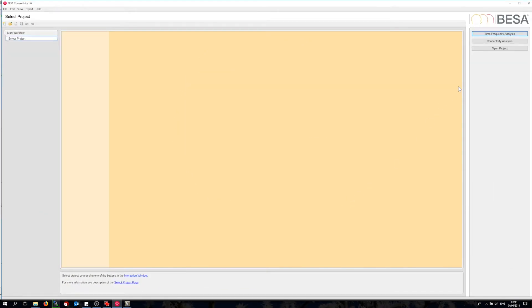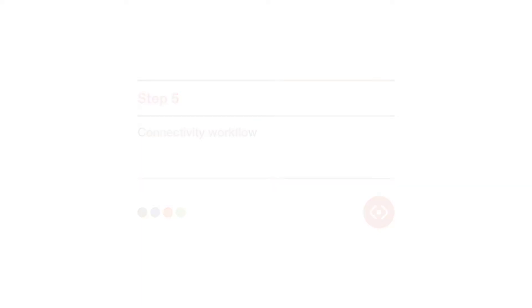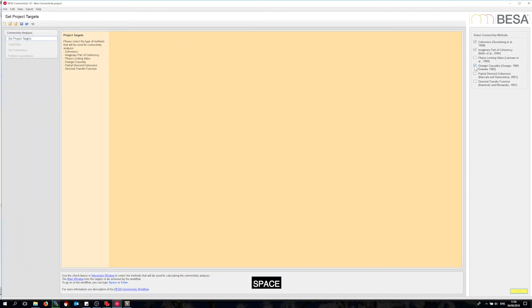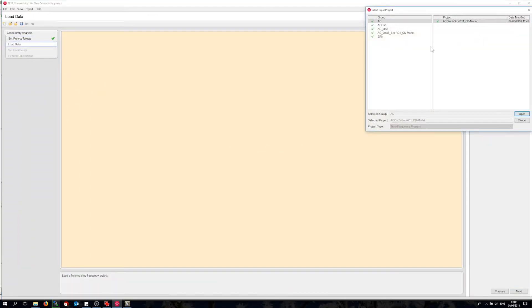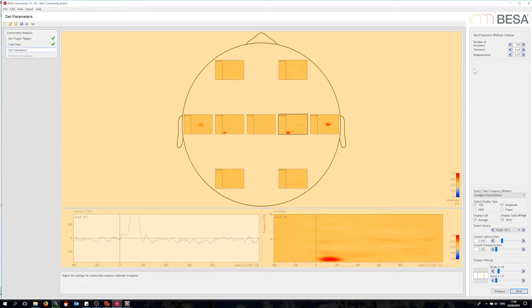The final step is to perform the connectivity analysis. For this purpose I will start a connectivity workflow. The first thing to decide is which connectivity methods I want to apply. I will try coherence, imaginary part of coherency, and Granger causality. Then I need to load the project. Luckily the time frequency project I just finished is already pre-selected. Now I see the time frequency result again. I can adjust some settings for the Granger causality analysis, but I will stick with the defaults and start the connectivity computation.